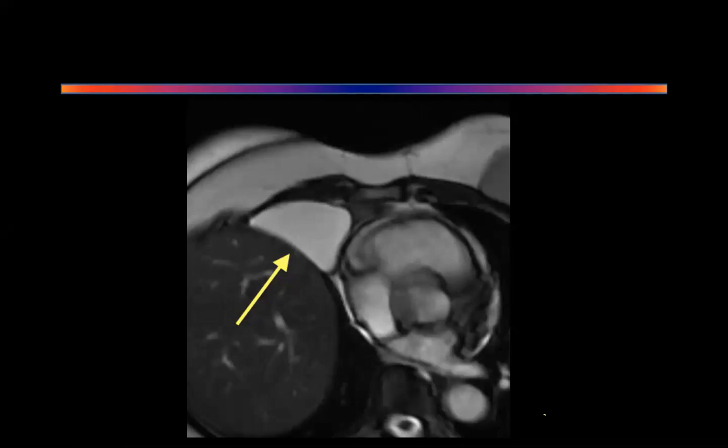It is a T2-weighted image showing a well-defined, enhanced, smooth-margined, single cystic lesion in the right pericardiac region at the level of the heart, the four chamber view of the heart. So my differential diagnosis would be a thymic cyst, pericardial cyst, or a bronchogenic cyst.